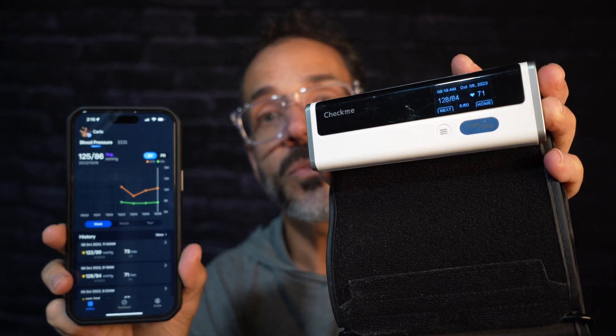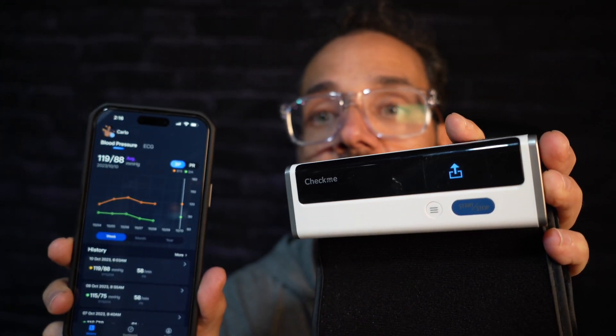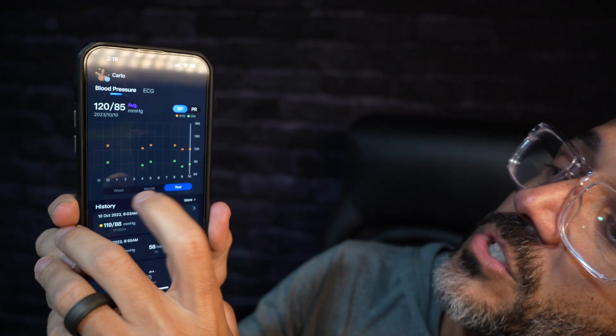The device is Bluetooth compatible, so if you have your phone, you open up the app called VI Health. It will sync to your phone and download your data. Then you can see all your blood pressures over time — the last week, the last month, or the last year. That's extremely useful when you go to your doctor; you can show them how your blood pressure has been reading without keeping a notebook or a log.